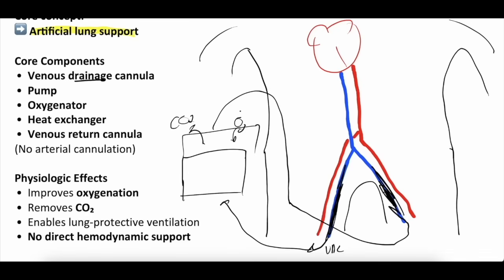Now, sometimes this return cannula can be through the neck, the jugular vein sitting in the SVC as well. So you could have one in the IVC and the SVC, which can be important because sometimes these are so powerful you get mixing where the blood coming from the return cannula is just being sucked right into the drainage cannula and it doesn't have time to actually circulate in the system. But I digress. This is why I'm so bad at keeping things in under 10 minutes.